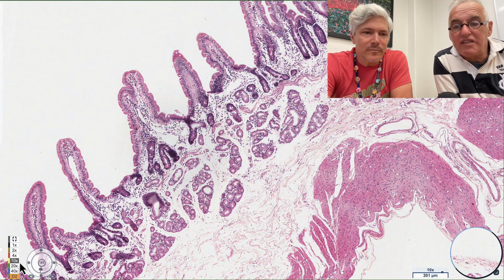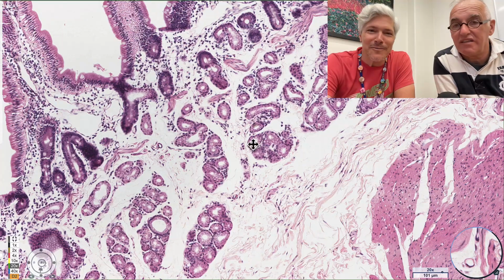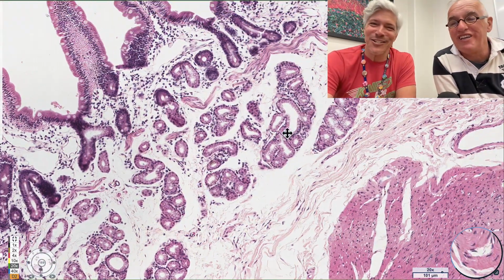Right on. So this is what is called Brunner's gland. I'd say Brunner's. Brunner? Just to be contrarian.